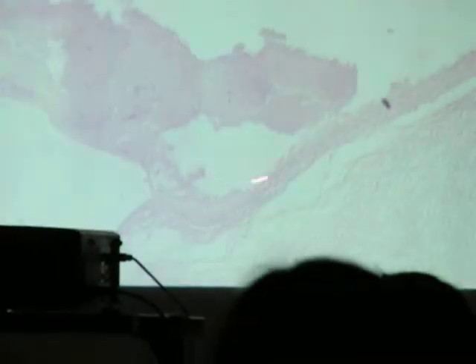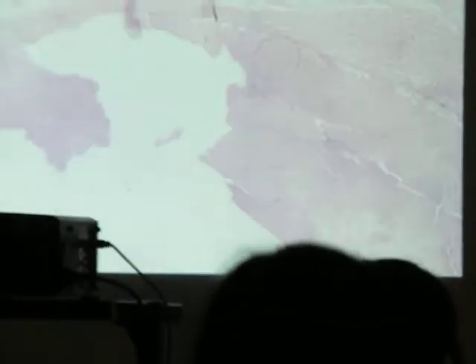Between is that portion, jelly. So again, artery there, artery on the other side. So they're very similar. All this important jelly. The very edge is the epithelium, the amniotic epithelium there, and then that big, huge monster is part of the vein. They're all really that big. That's one slide.